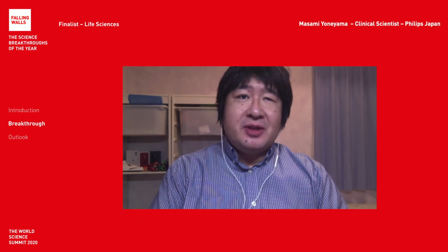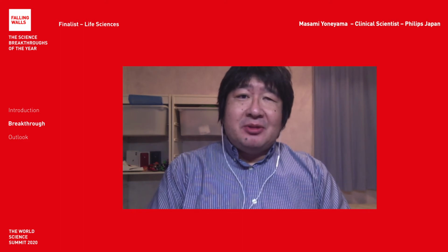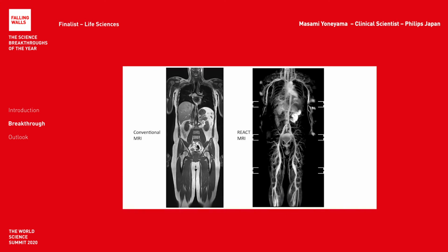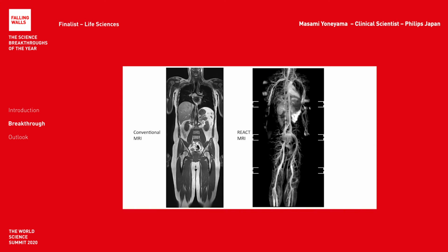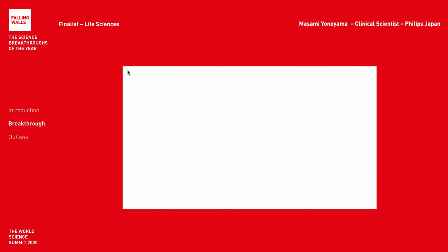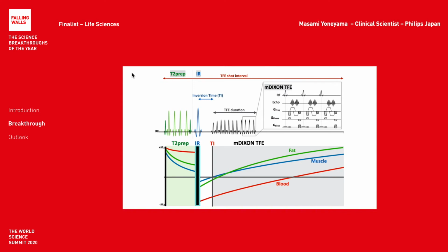The breakthrough innovation is really about how to overcome the bottleneck in MR signal and contrast to be able to obtain good physical signal from the blood, at the same time to get rid of the signal from the background tissues to generate sufficient contrast for the vessel at the end. In the MR images, different tissue types present different signal intensities because they have different physical conditions and chemical environments. Now, there are several technical components that are critical in REACT MRI. They are all achieved by controlling and combining the high-frequency pulses and magnetic gradients in a specific way.